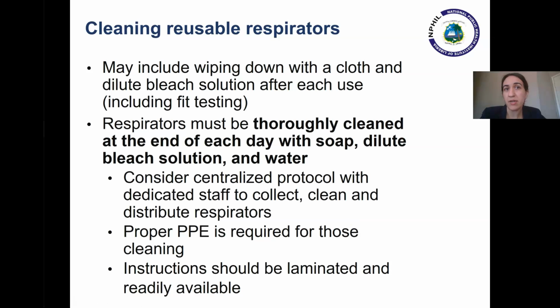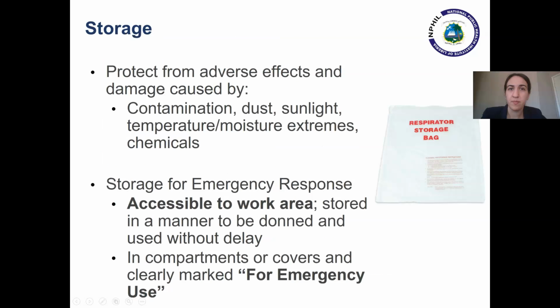Elastomeric respirators are designed to be reused. Wipe down cleaning of the respirators is recommended after each use, including during fit testing. Deeper cleaning should be conducted at the end of a shift. For maximum efficiency, your program might want to make this a centralized protocol with dedicated staff. Remember that proper PPE is required for those cleaning the respirators.